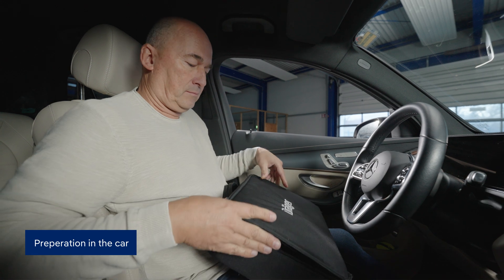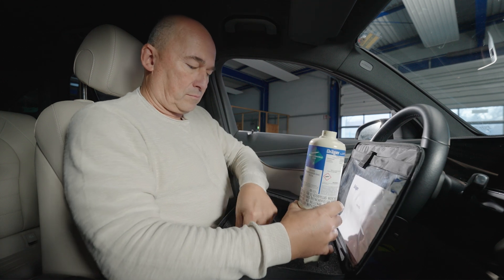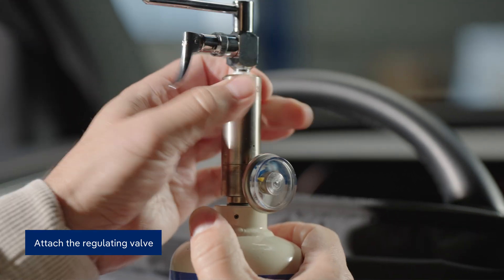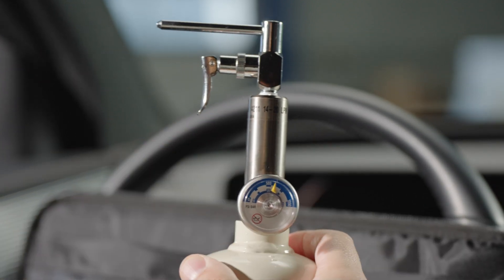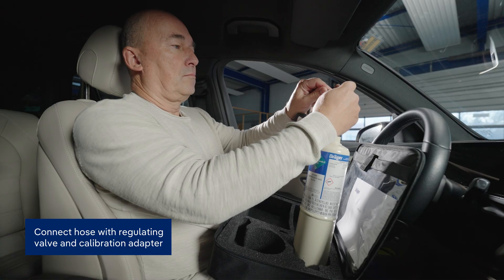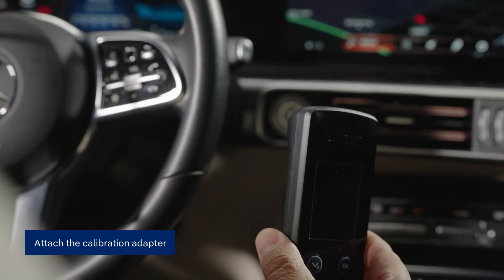Take these items into the vehicle and sit in the driver's seat to begin the calibration process. First, screw the pressure regulator onto the test gas cylinder. Next, connect one end of the hose to the pressure regulator, and the other end to the calibration adapter. Now, place the calibration adapter on the interlock handset.